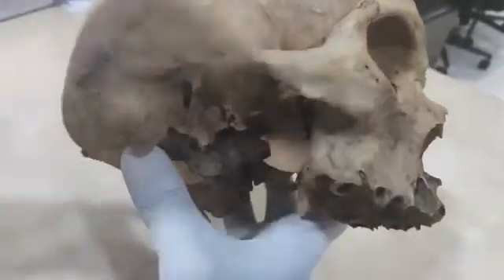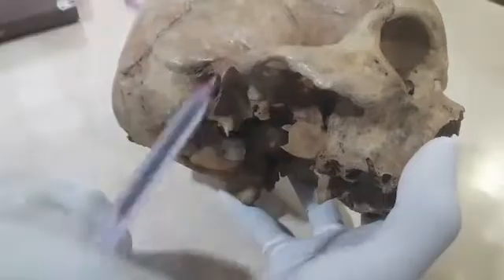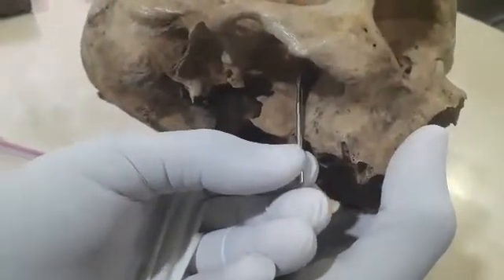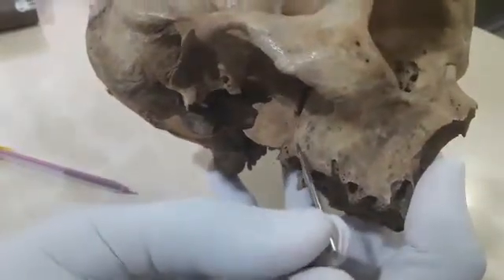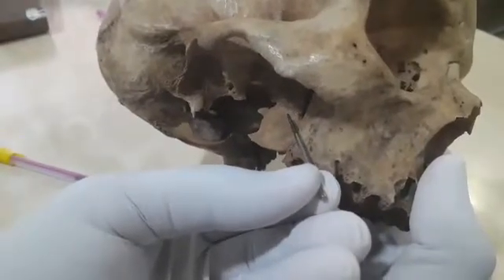This is the fissure area. You should never approach till here — see how much length this is. See from here to here. This is the wrong angulation. Your burrs should go like this and perforate the base of the two pterygoid plates.